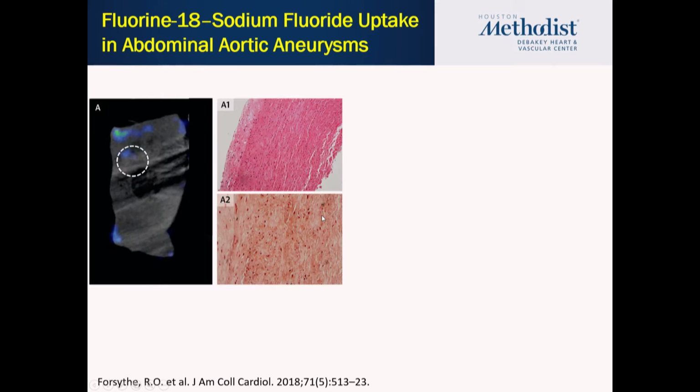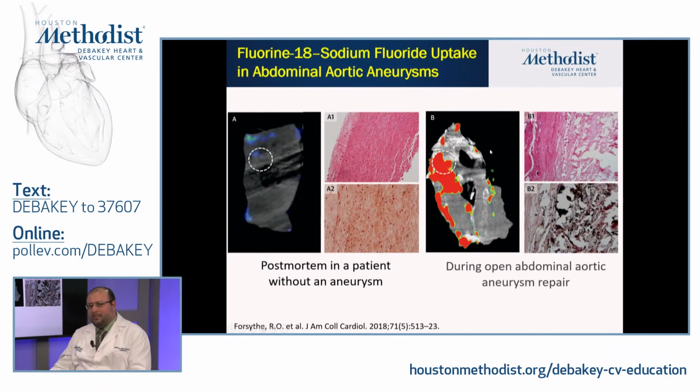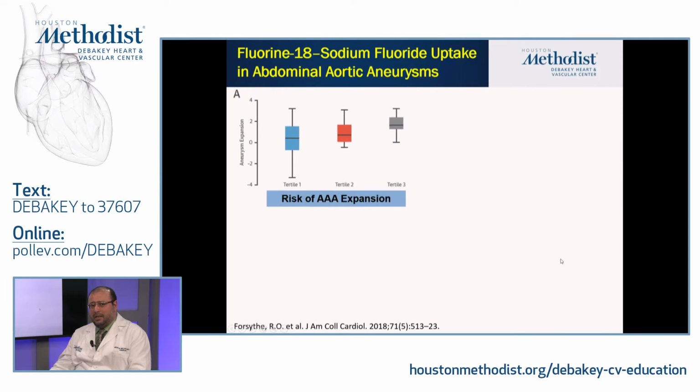When they looked at nearly 72 patients, among those who went for surgery, the uptake correlated with inflammatory cells at the time of aneurysm repair and resection. But what is more important is the outcomes data, which looks at the risk of expansion. As the uptake of this sodium fluoride increases, the risk of expansion increases significantly.